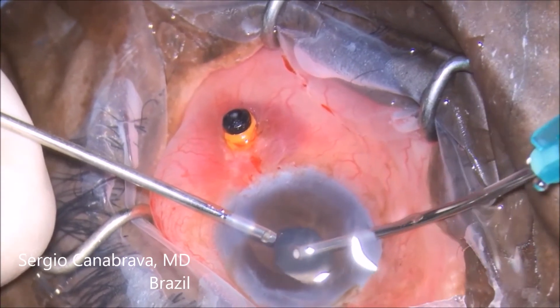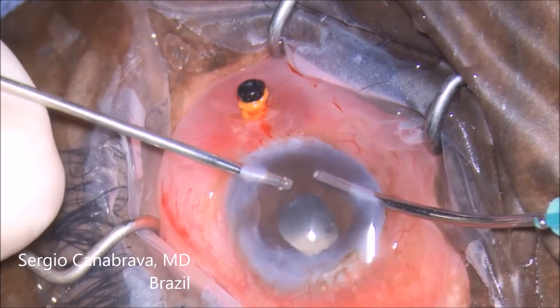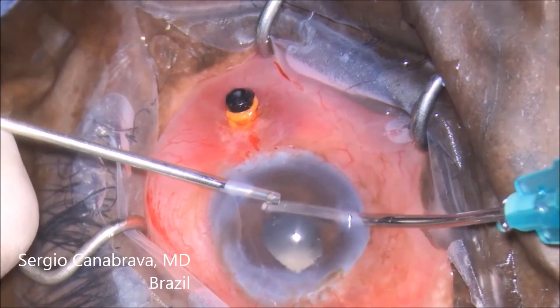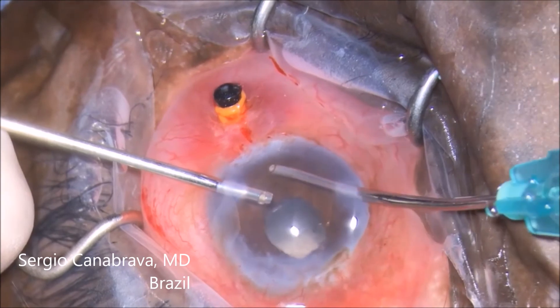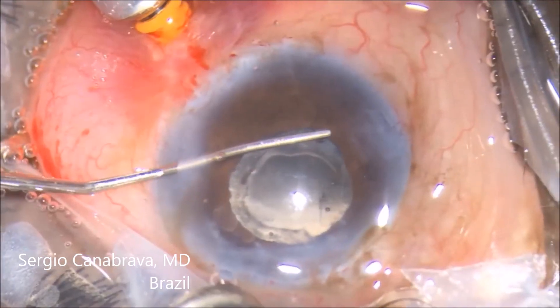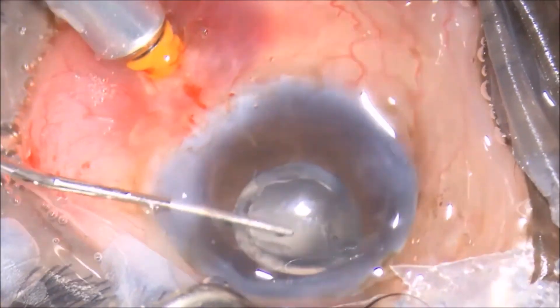Now we can see how it looks at the end. A little vitreous remains — cut it. Now the eye is prepared to implant the IOL. You need to confirm whether there is IOL support, but that is not for today — it is the topic for the next class.